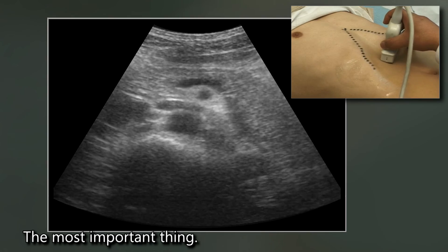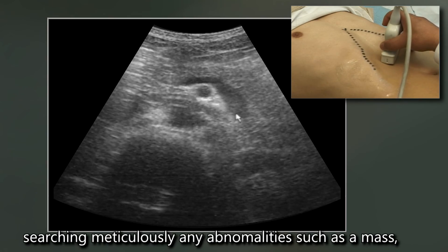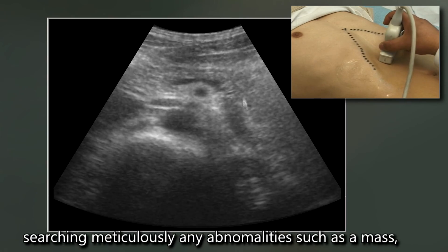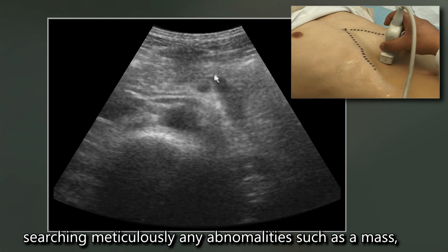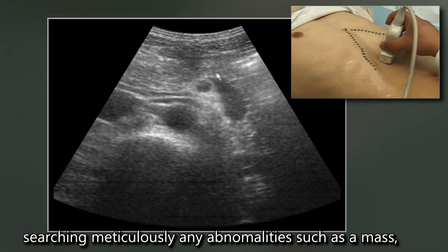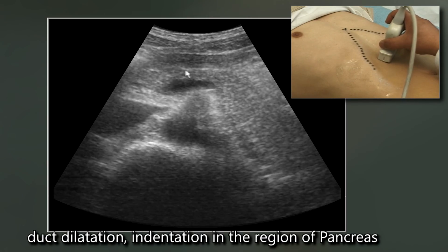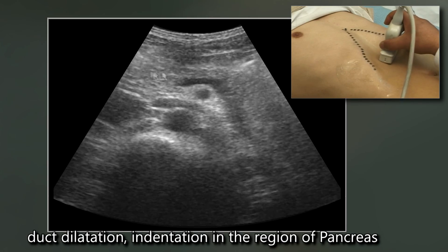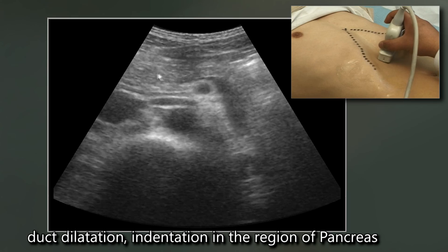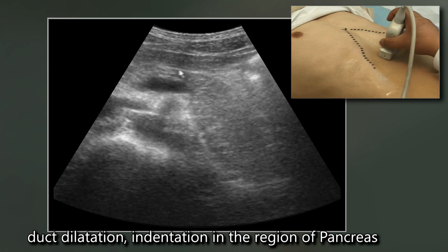The most important thing is searching meticulously for any abnormalities, such as a mass, duct dilatation, or indentation in the region of the pancreas.